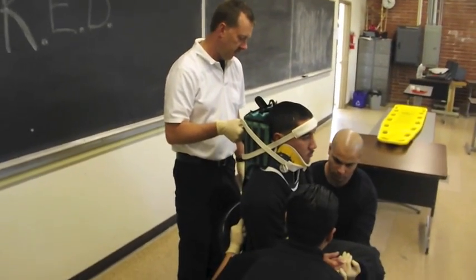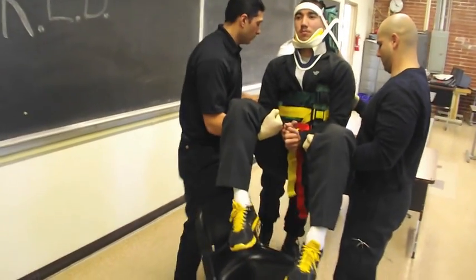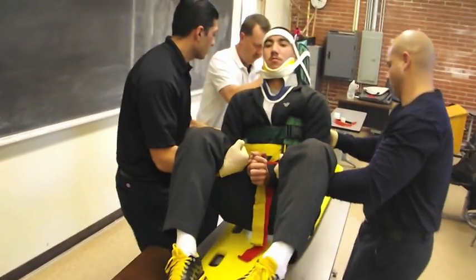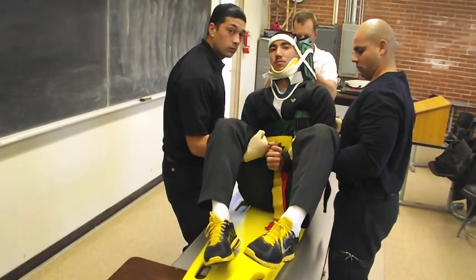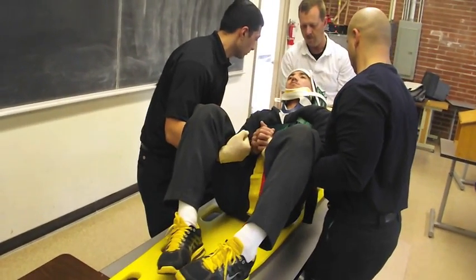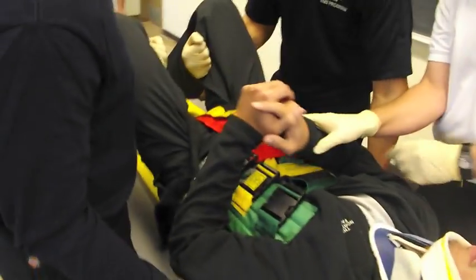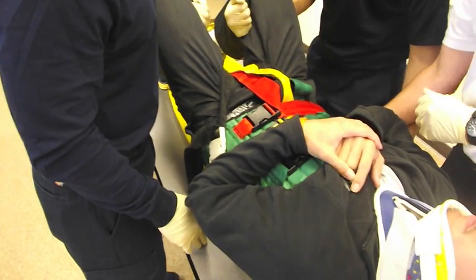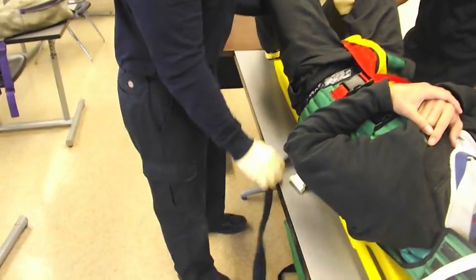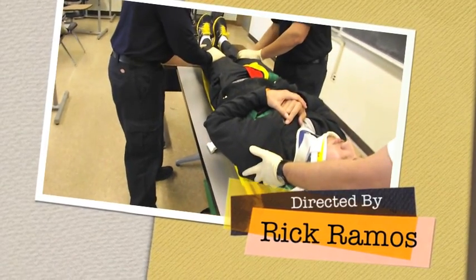Ready to move? I'm going to count. One, two, three. Without Lewis and Marcus holding his legs, this would cause a great deal of pain for the patient. Move him down on the board. One, two, three. Even though he's laying down, they're still going to hold onto his legs until they release the two black straps. As they do this, they'll lay the patient's legs flat on the spine board and continue C-spine while the patient remains in the KED device.